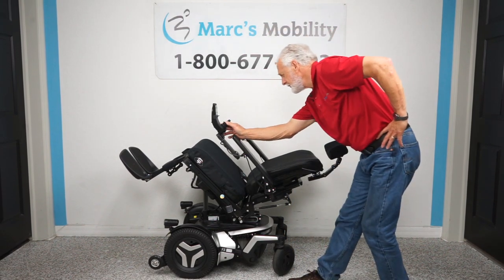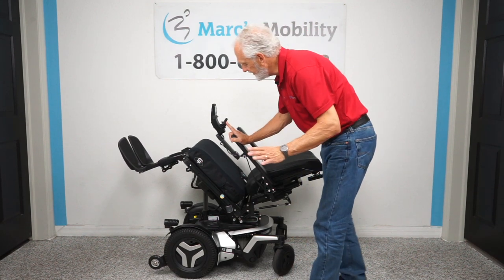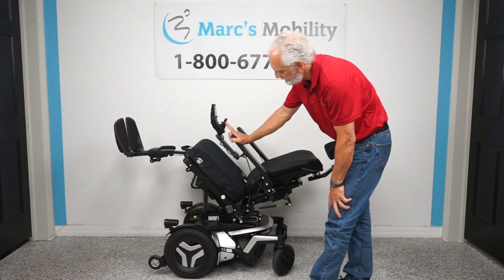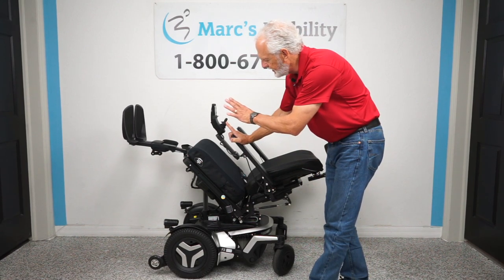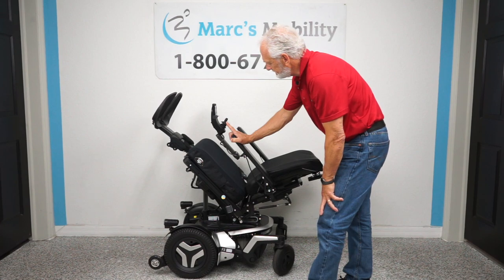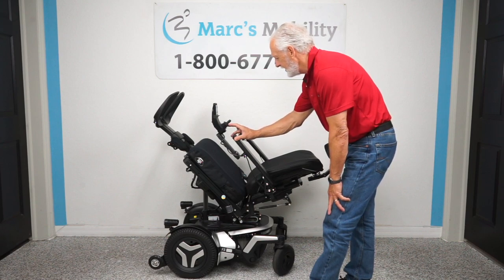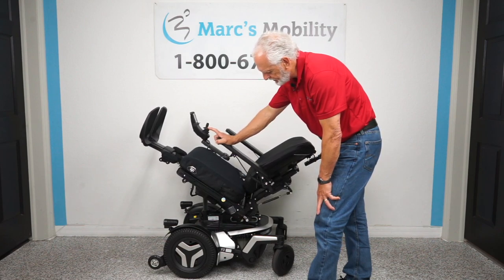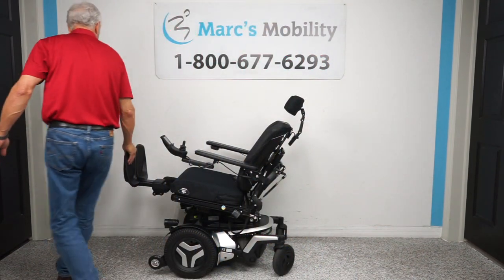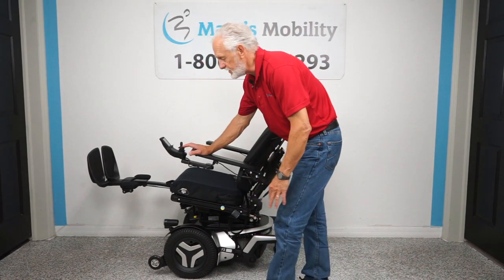Now I'm going to bring the legs all the way up to show you that you can get your feet higher than your body. Here's where your knees would be, but this is going to get your legs and feet up there. That's a little extreme — I'm not saying you should do this — but look how far up they go. You can pretty much get your feet up to the ceiling. You can adjust it with infinite positioning.